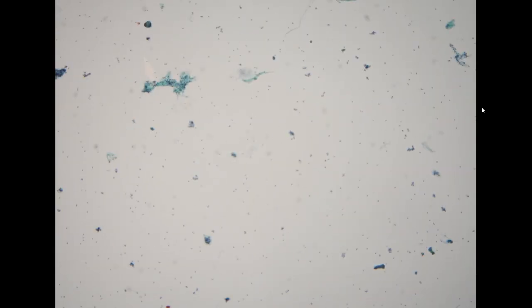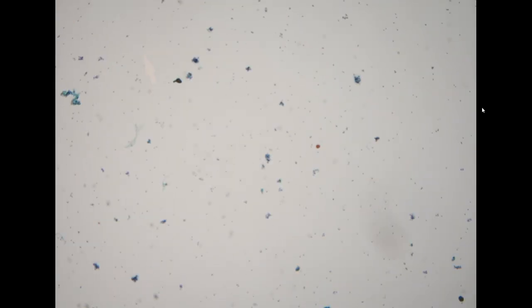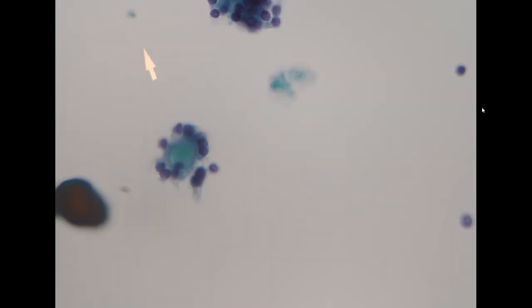So again, a different specimen. We see very scant colloid in the background, and we see a lot of these small, tight clusters of microfollicles. So this is also a case suspicious for follicular neoplasm. So we have 3 follicular tumors today. 2 of them were the usual type, and 1 of them was Hurthle cell, oncocytic type.